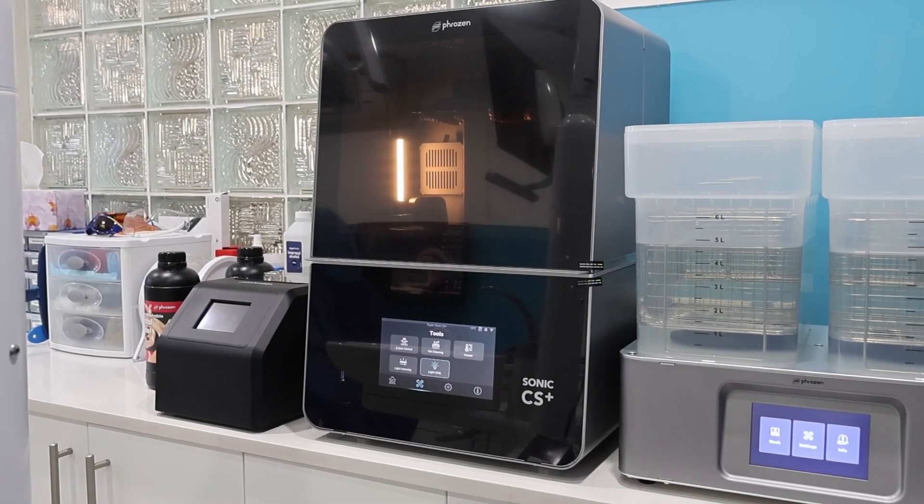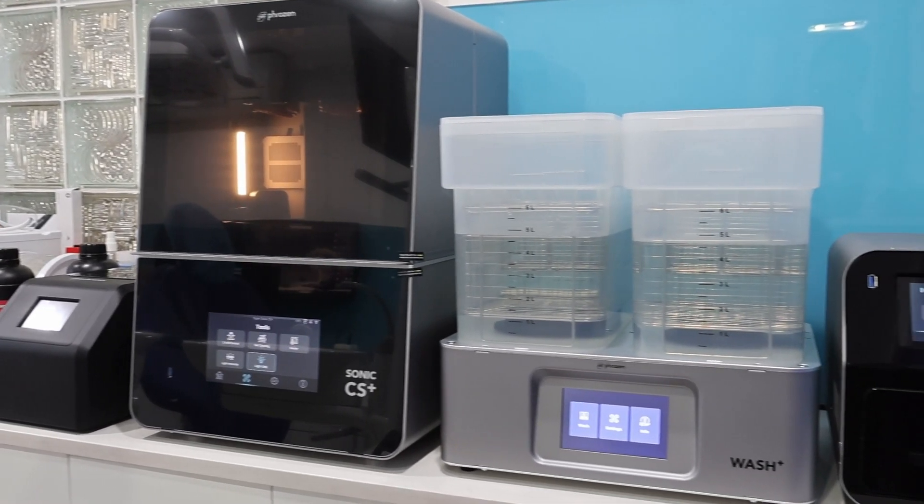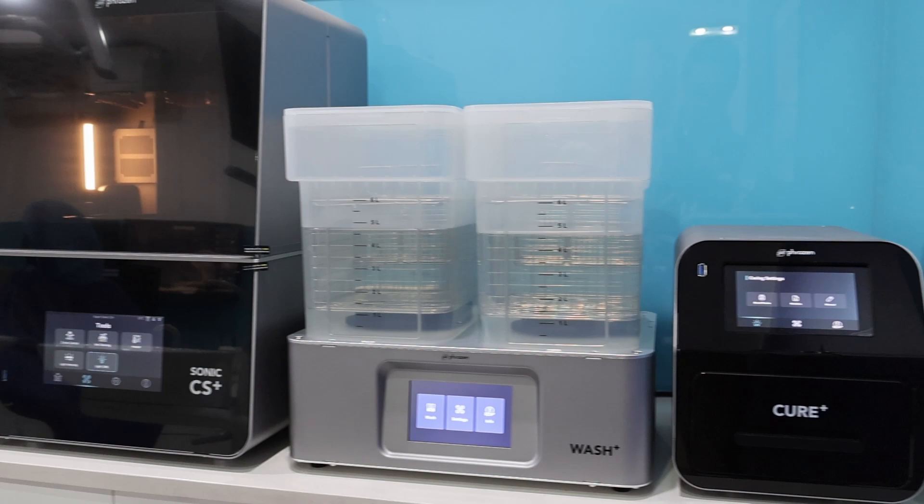I've had the privilege to test out the Frozen Sonic CS Plus over the past few months, and honestly I'm impressed. It's a robust lineup — you have the Frozen Sonic CS Plus, their Wash Plus, their Cure Plus, and a heated resin roller as well. Overall, the lineup is very consistent, reliable, and a very solid pickup for anyone looking to get value from their dental 3D printing system.